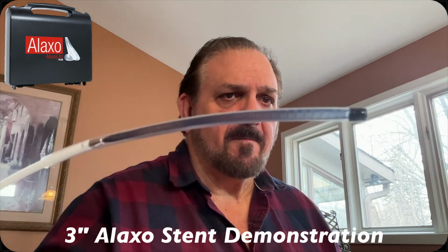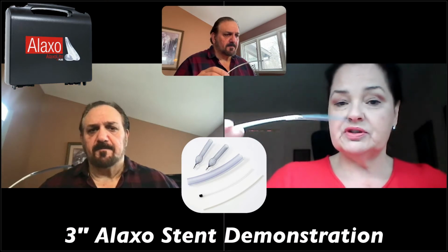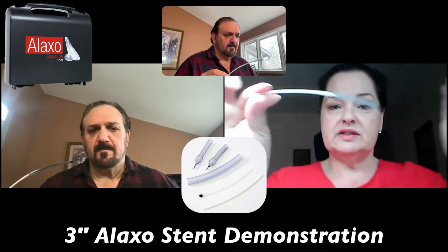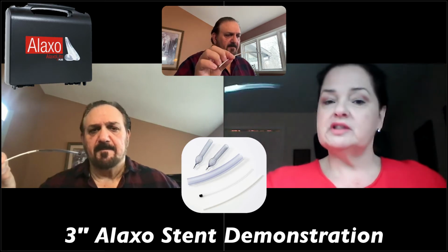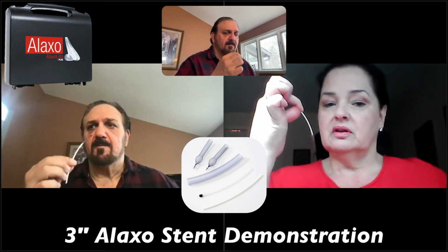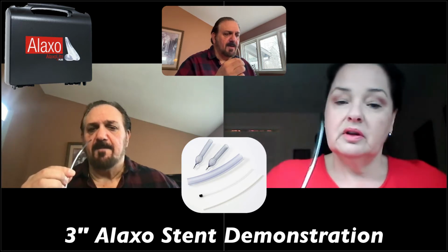Sometimes, depending on the individual, we'll recommend things differently, because we're going to do the insertion now. When you're doing the insertion, notice that there is a bend in the tube as well. So you want it to be going downward, because we don't want to be going upward. Okay, I got it.